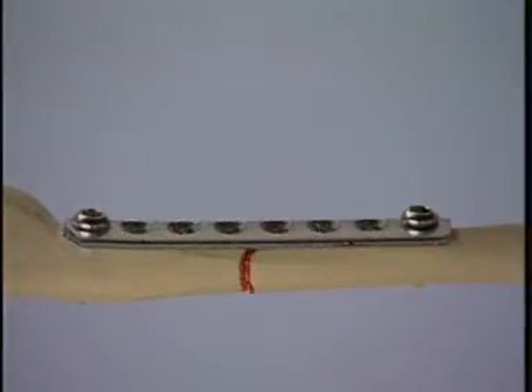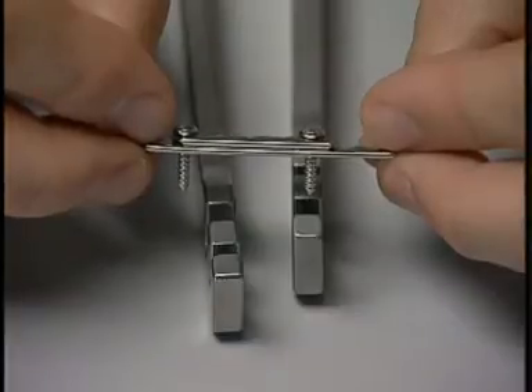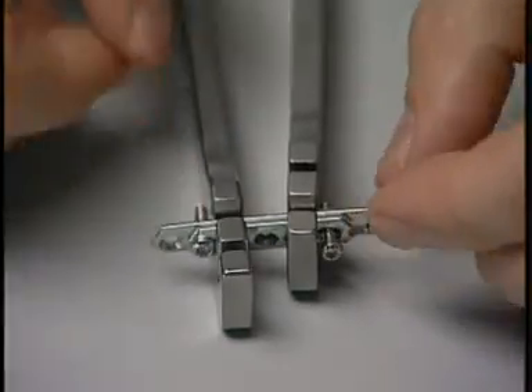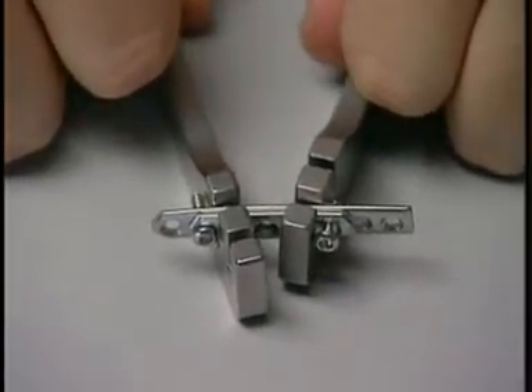If the plate needs additional strength, cuttable plates can be layered. Should these plates need to be contoured, screws should be placed in the end hole so that the contouring is even throughout both plates.